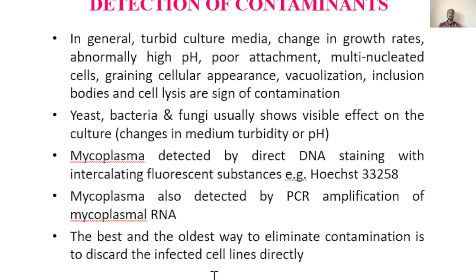The best way to eliminate contamination is to discard the infected or contaminated flask, so that we can save the other flasks that we use in the same incubator or same cell culture lab.